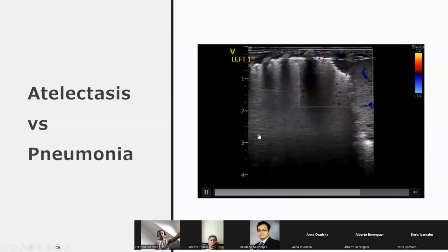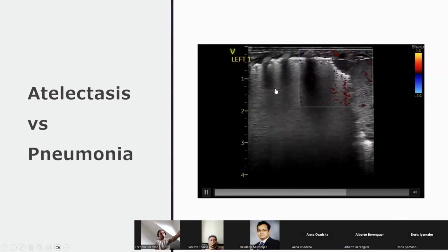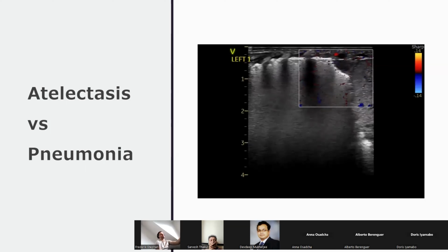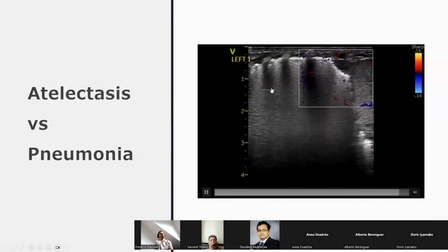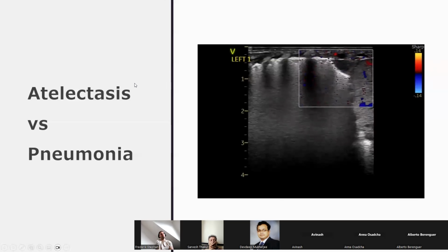And the question from your perspective is: is this just interstitial edema, or is there an element of recruitment that will convert this B profile, which is technically AIS, into maybe well aerated lung? And in the acute phase, like if you have RDS in this particular situation, increasing volume guarantee and increasing volume might convert this into a complete A profile really within half an hour. And that is what we saw with scans that Surjit basically showed us in the last image.